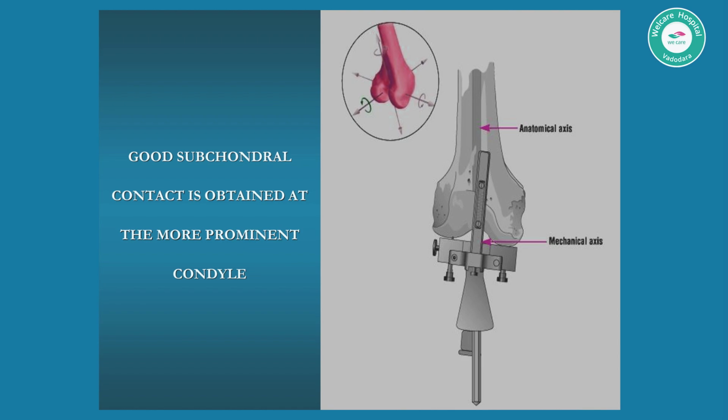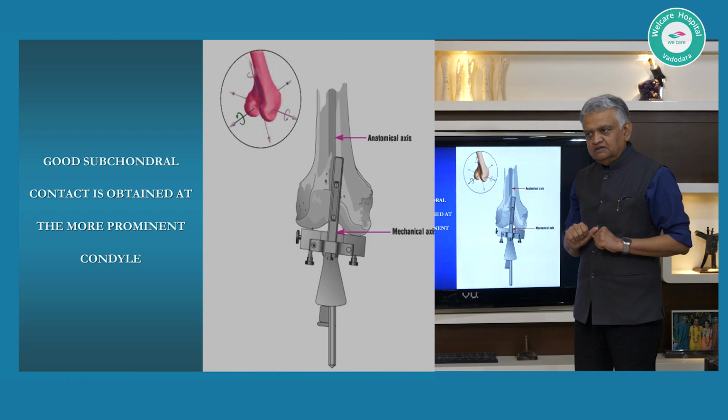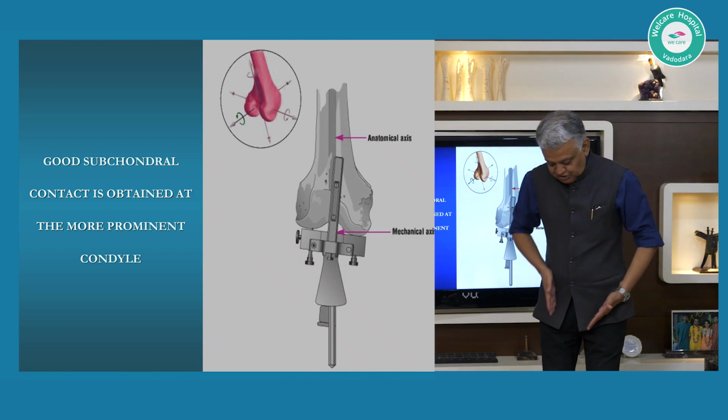Most of the time, the vast majority of surgeons do not get this explanation in their formative years. So they just have a mechanical, superficial level understanding: do this and set it at 5. But why 5, why 6, what might be the systematic way? Even if you have understood, you might decide that every time you will use 5, but at least you should be aware of why you want to keep 90 degrees to the mechanical axis.